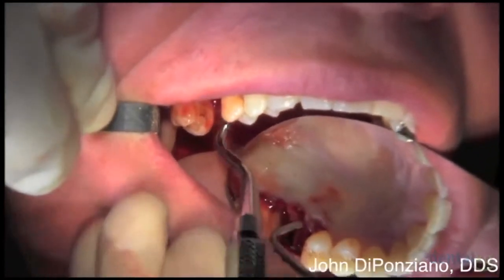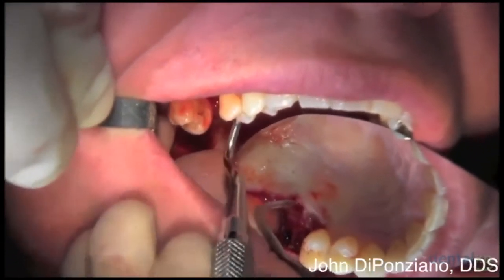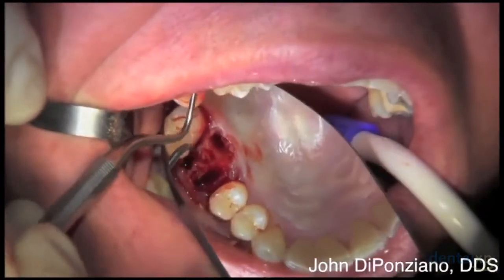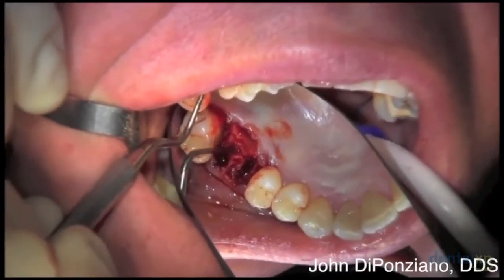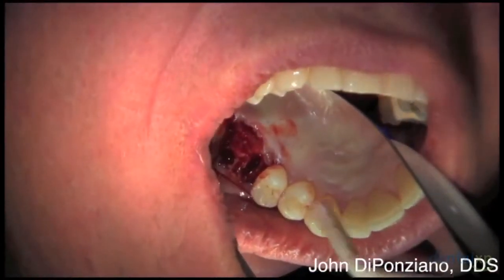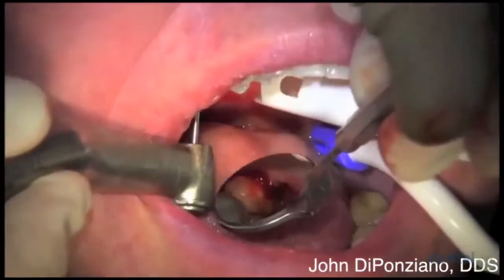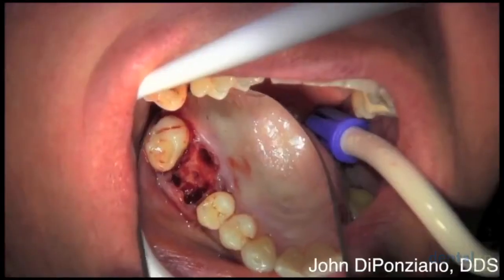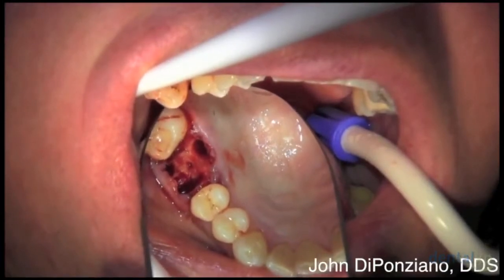Notice no vertical releasing incisions were placed. By using this curette, you can get underneath and undermine it pretty well. There's a nice-sized furcation and intercrestal area, so we're going to place the implant right there, using that same Comet burr to get a purchase point to start the osteotomy right in the middle.